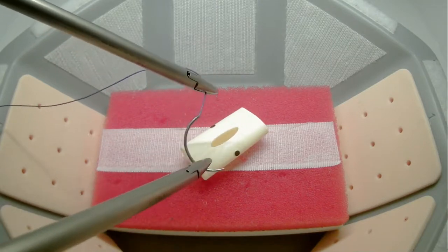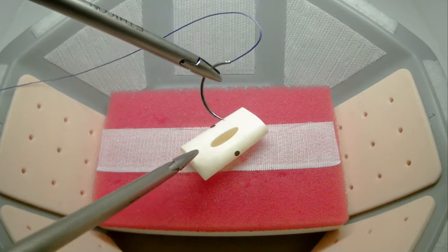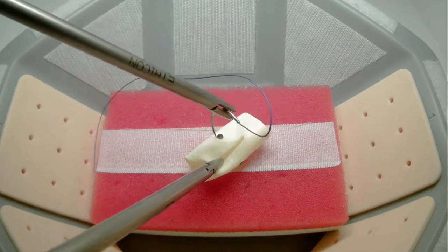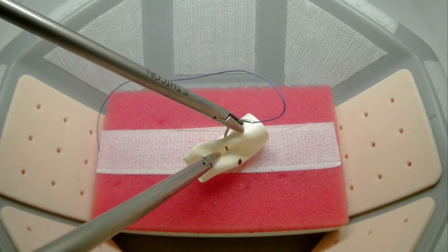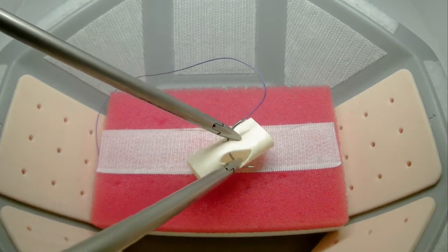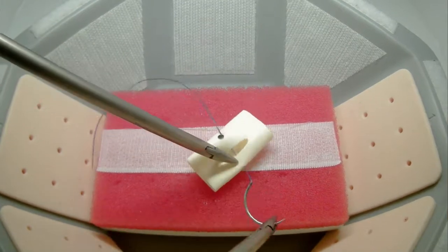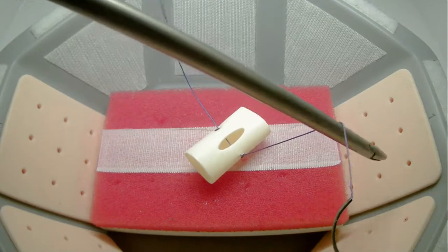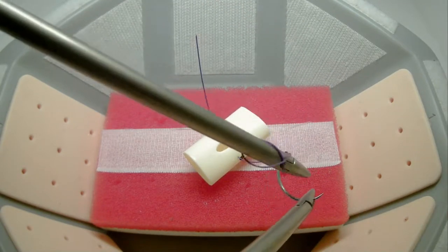You are required to introduce the suture into the lap trainer by holding the suture, not the needle. You will use the instruments to pass the needle through both marks on the penrose as closely as possible. Any deviation from these marks will be considered an error. Your first throw is required to be a double throw.